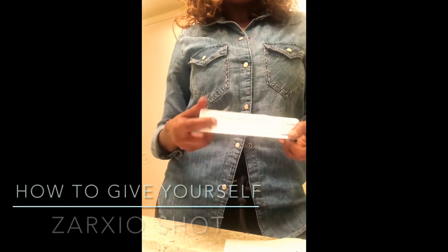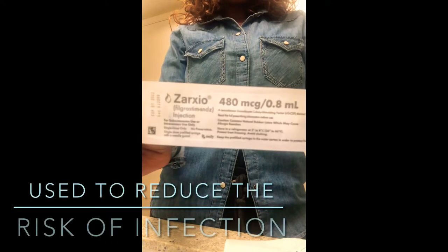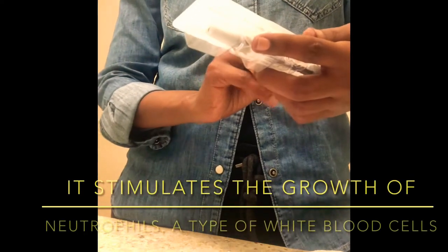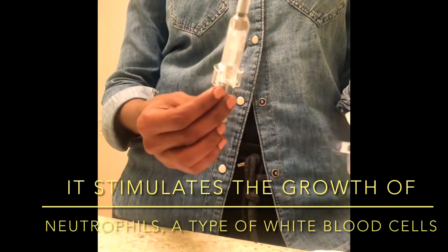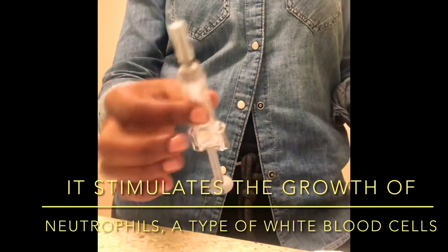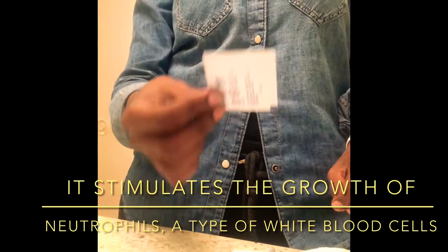I'm going to demonstrate how the Zarxio is given. This is called Zarxio — it's a prescription injection given to patients who receive strong chemotherapy and also have neutropenia, meaning low blood count. This helps boost the blood counts. I have it here; it usually stays in the fridge but I take it out for 30 minutes to reach room temperature. I have a bandage ready and an alcohol swab.